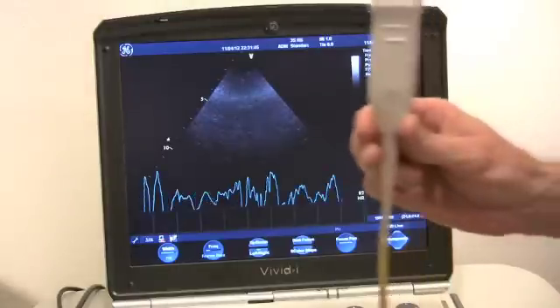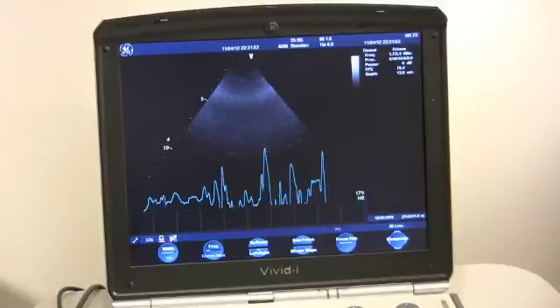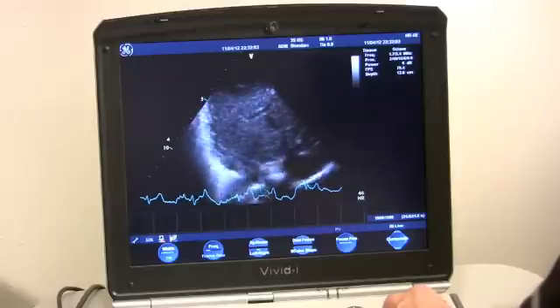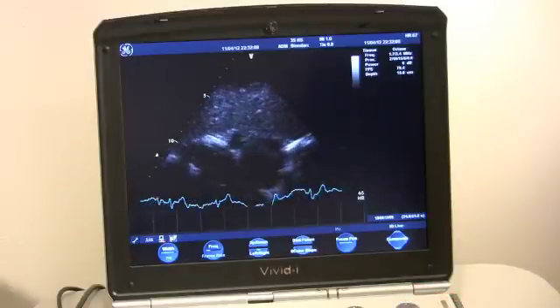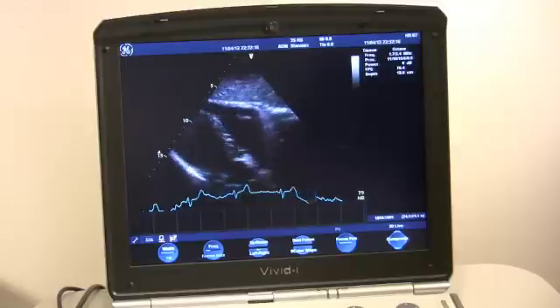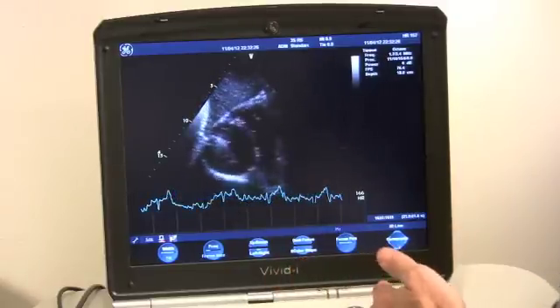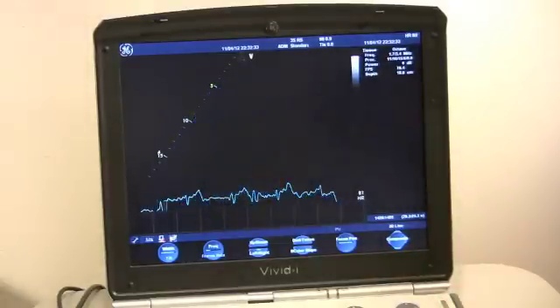We are going to look at the cardiac probe. Again, we're not showing great pictures — I'm just trying to show you that everything works. You can see that the TGCs work. There we go. So that's the cardiac probe.